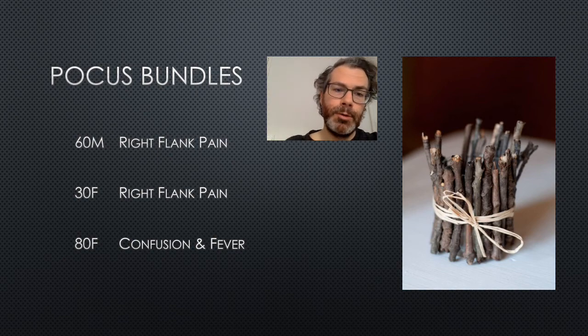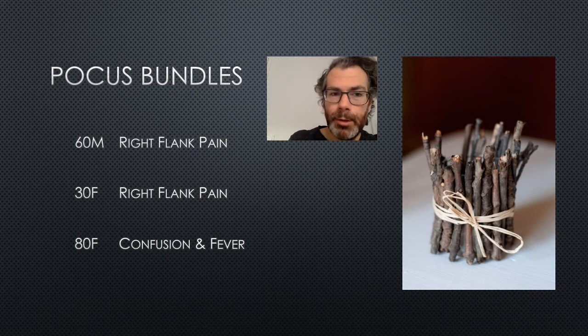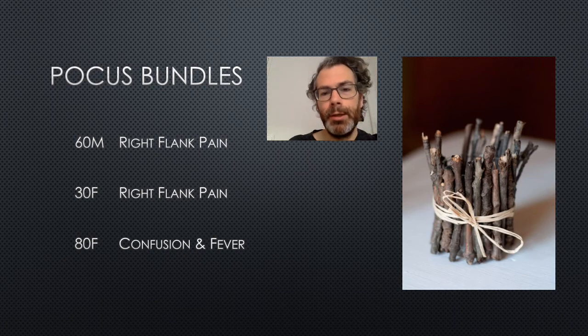So I think the point-of-care ultrasound exam should follow the clues in the clinical history and examination. So just how your physical examination follows the clues in your history, so your point-of-care ultrasound should almost be like an extension of the examination, following the clues in the preceding clinical exam.